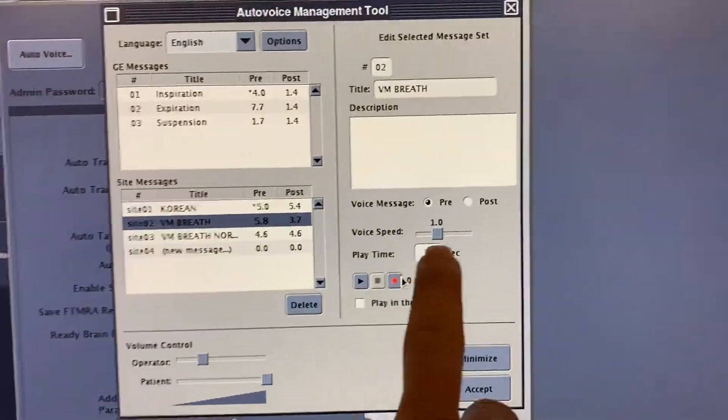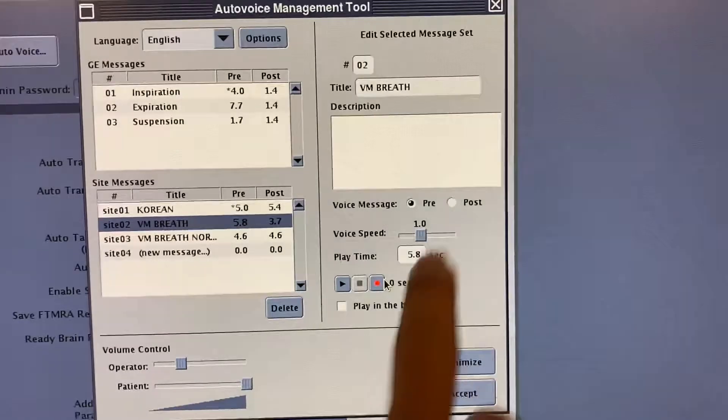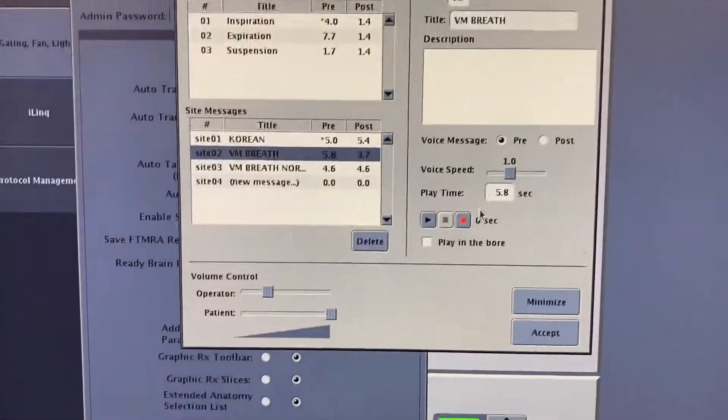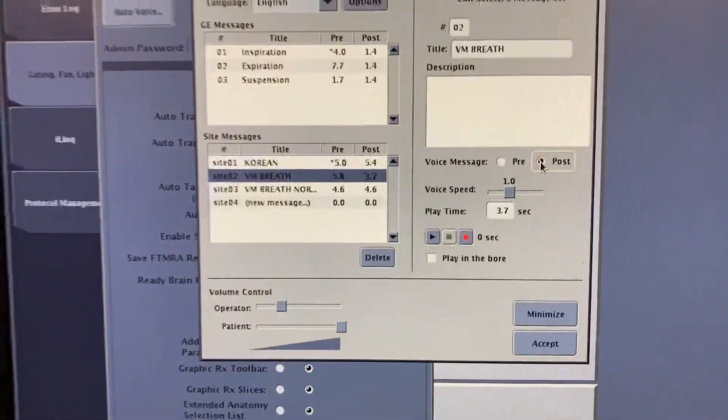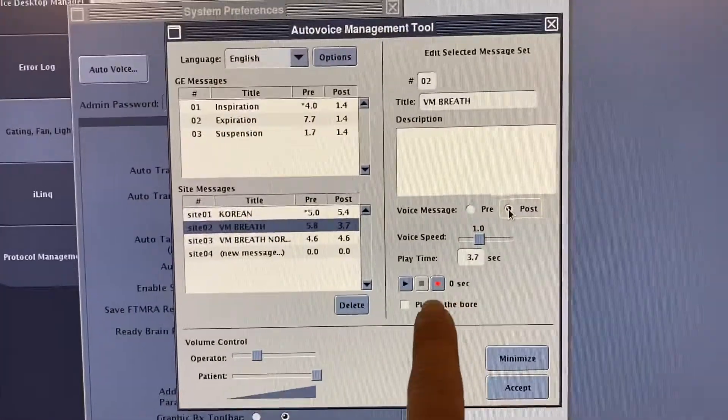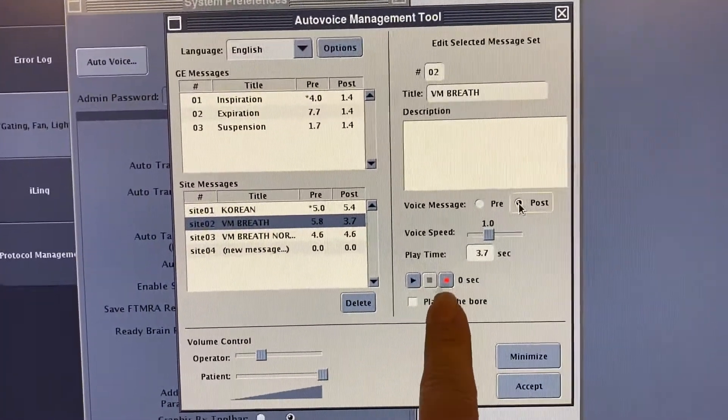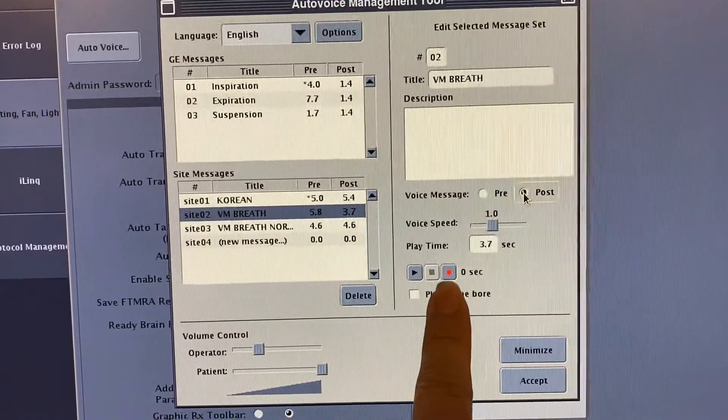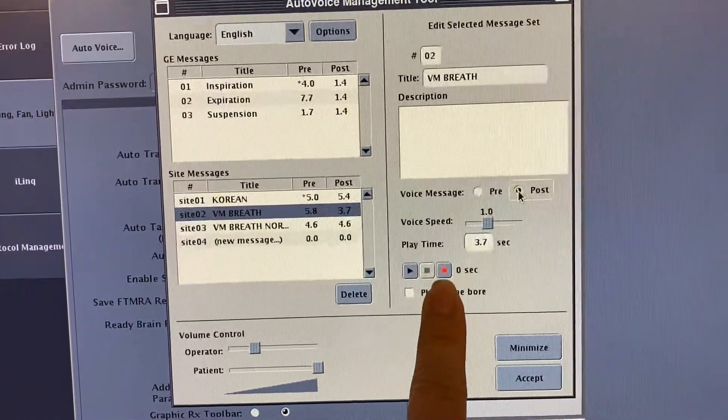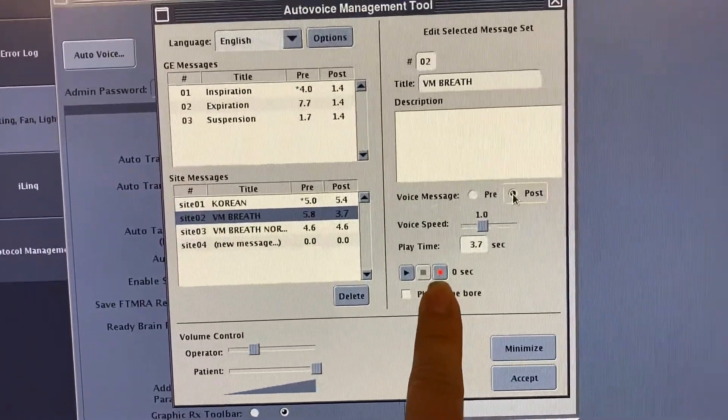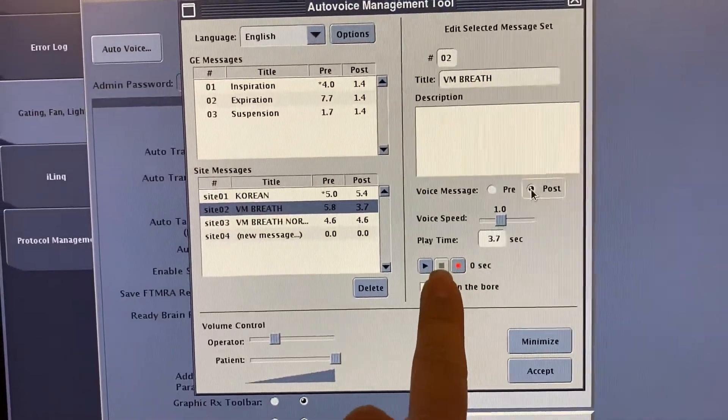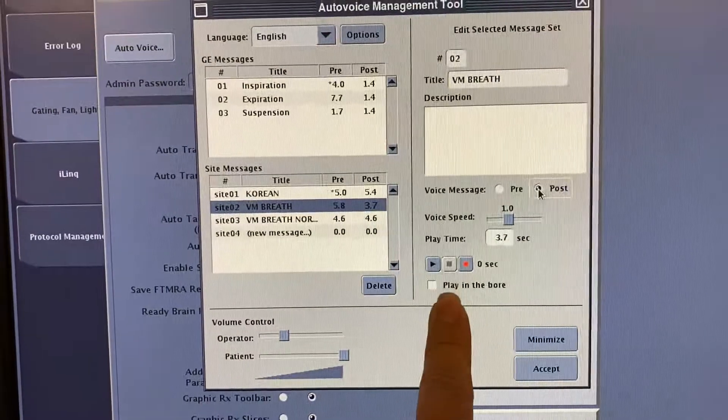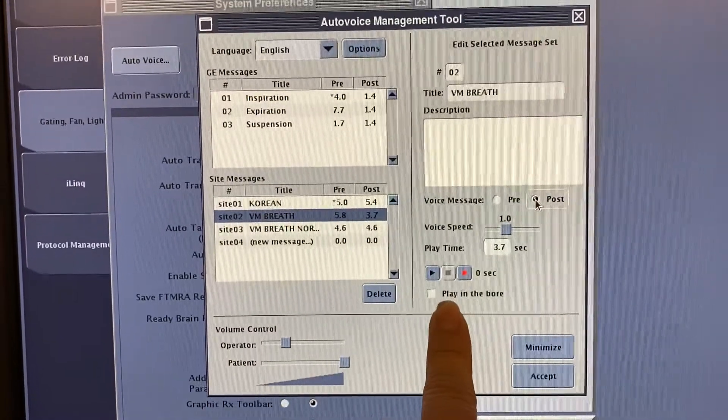Then I'm going to go to post. Click on post and record saying 'breathe' or 'relax' or 'breathe normal,' something of that nature. Then hit stop, and now you're set.